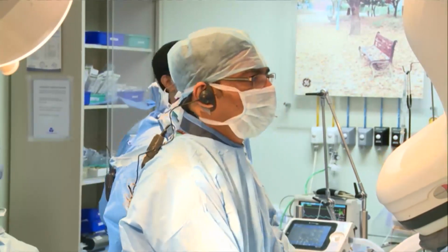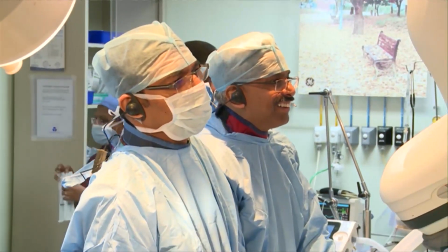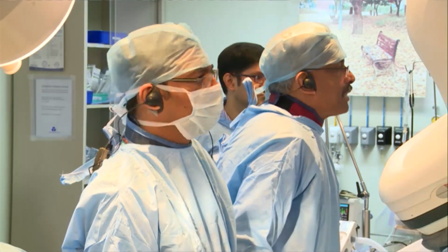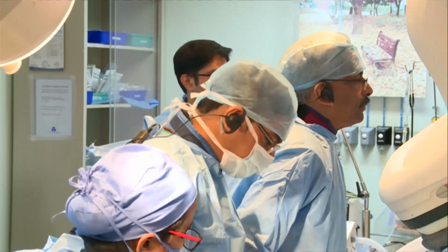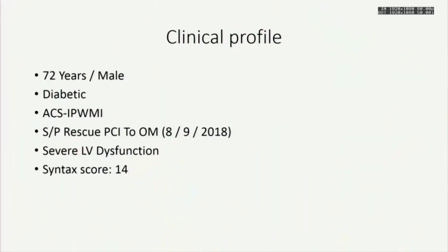Okay, this is that OM plain ballooning done, and let's hope we get a tight osteoproximal LAD lesion. The same patient. Yes, sir. Please tell us a brief history, Vijay Kumar. So let's just go through that history. Let's put the slides up. Get that other balloon ready.